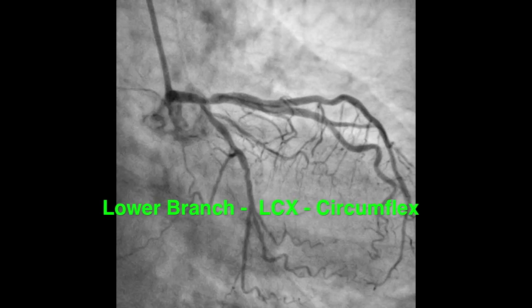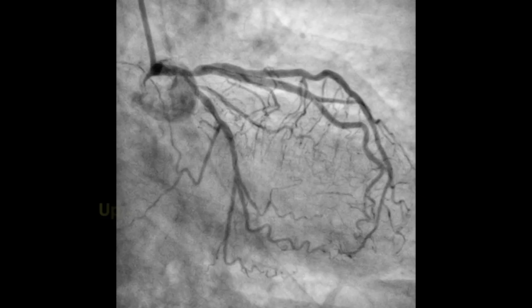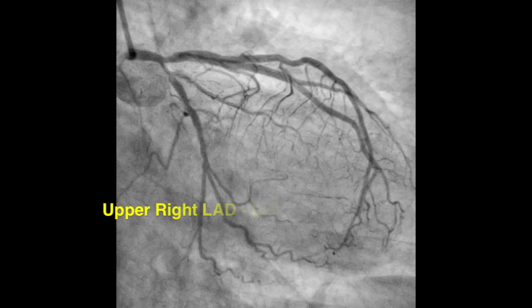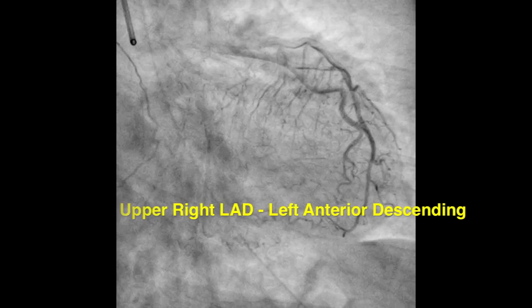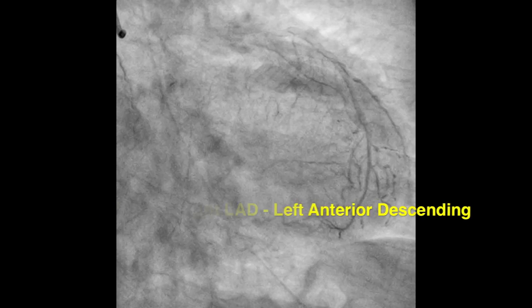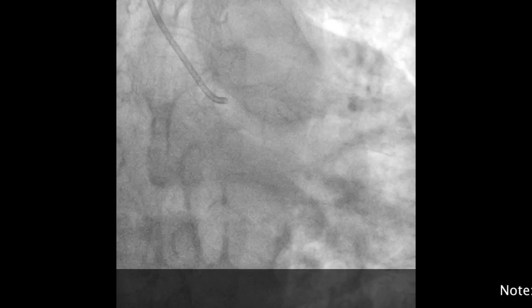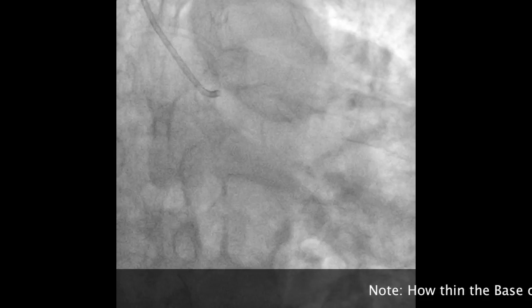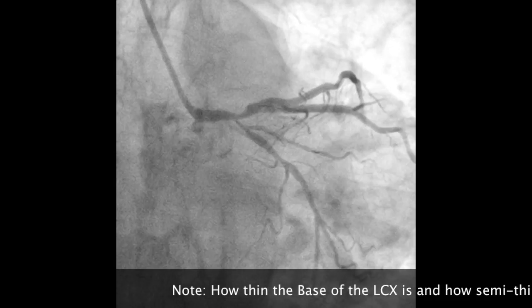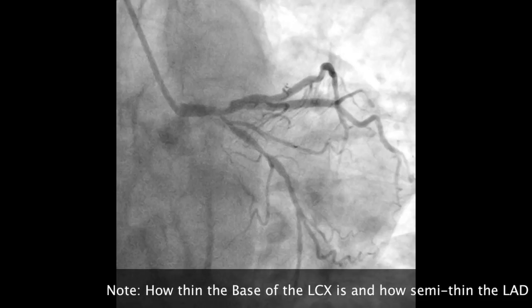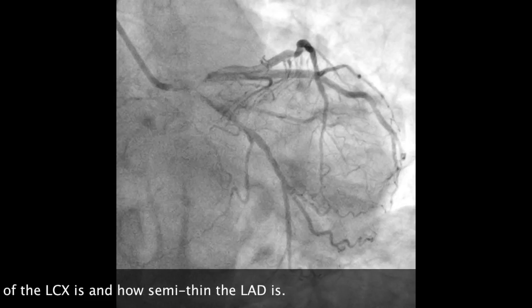Here we're looking at the coronary catheter angiogram of myself. We see that the lower branch is the LCX or circumflex artery, and the upper branch is the left anterior descending artery.